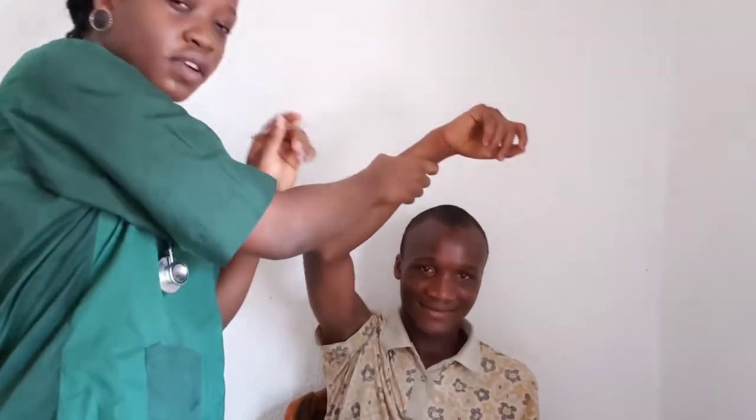Starting off, I will use the wet swab to clean the thermometer from the top to the bottom before I use it on my patient. After that, I will locate the axilla — the middle of the axilla — and the tip of the thermometer will go into place. I will leave it still for three to five minutes for it to read very well. That's for the temperature — very easy, pretty simple.